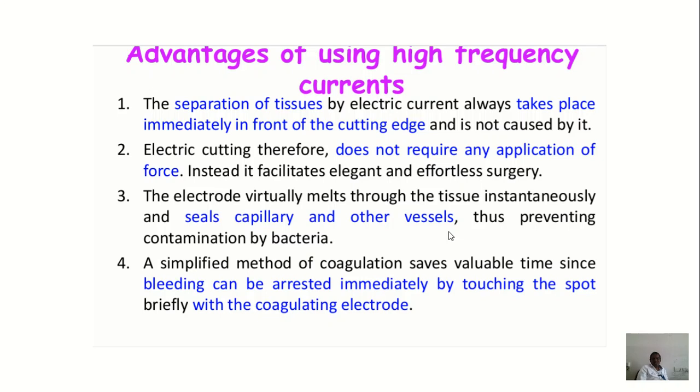But here we are using diathermy, that is heat. Because of the heat, the point of contact seals capillaries and other vessels, thus preventing contamination by bacteria.